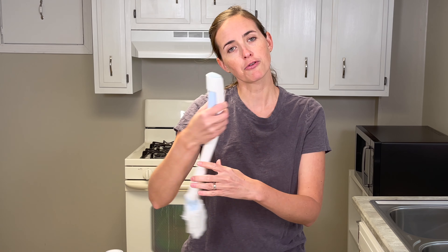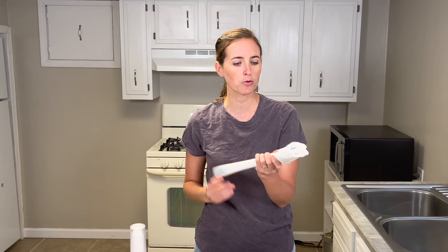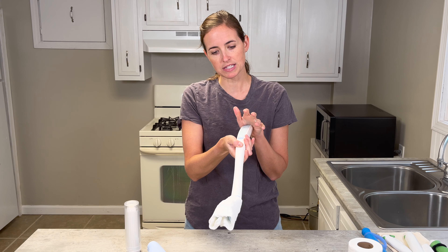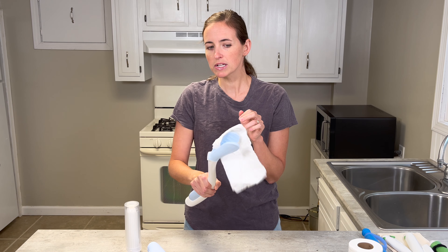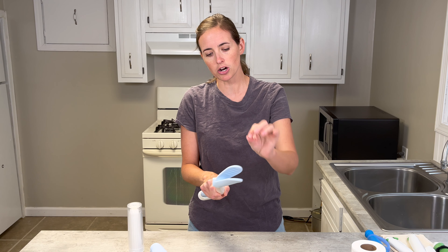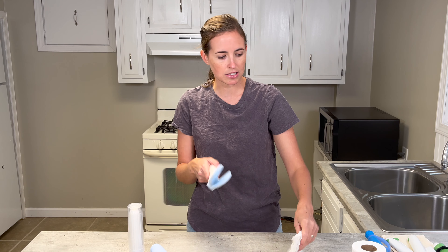From there, you can reach back and do your hygiene — coming in from the front or the back, wherever you're most comfortable. When you're done, simply release it with a press of the button. This one has a tighter grip, so you may need to shake it a bit or even start it with your hand before releasing it into the toilet.